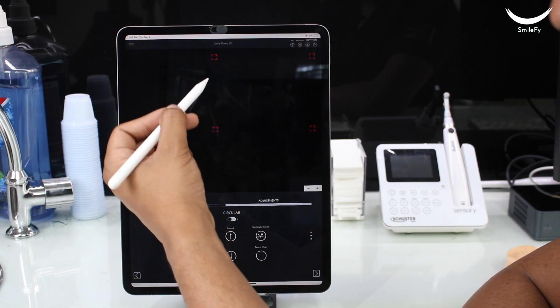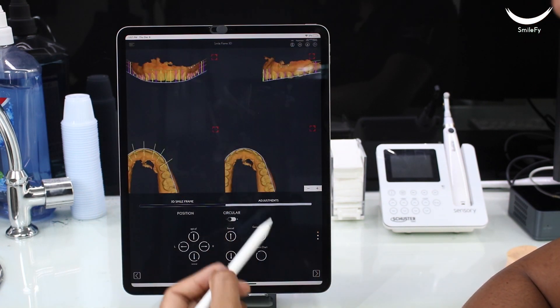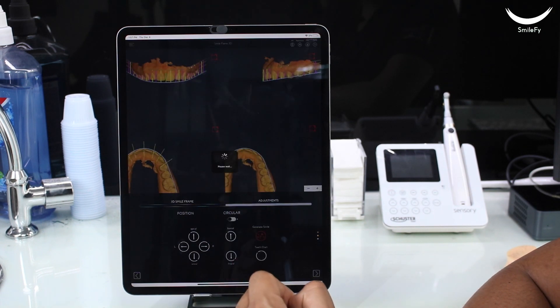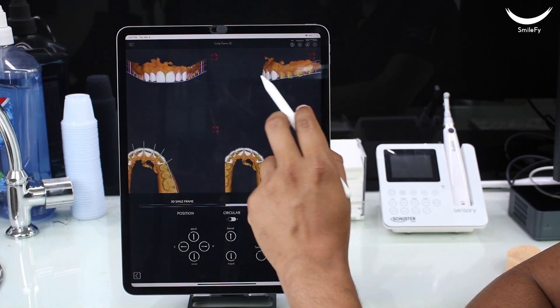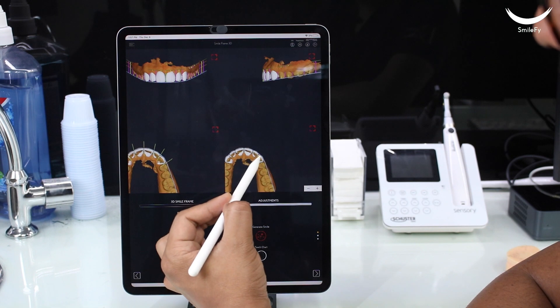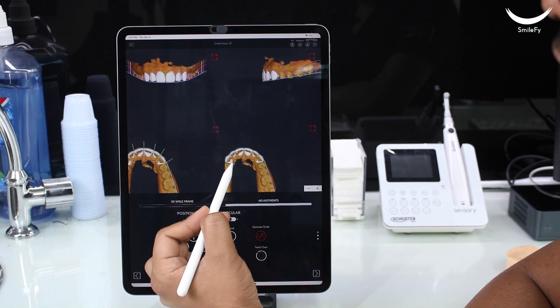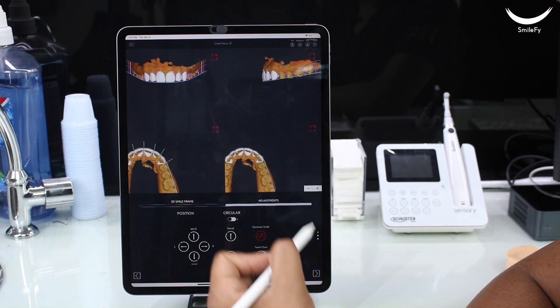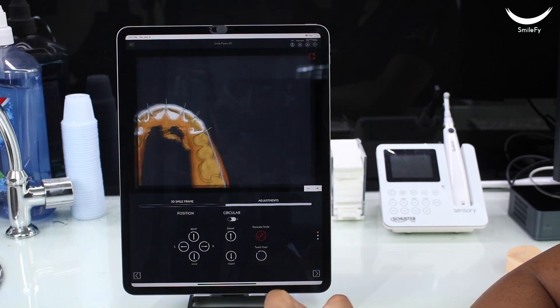You then select the units that you want for your dental wax-up. With the 3D Smile Frame in place and the number of units pre-selected, the software will automatically generate a 3D wax-up.